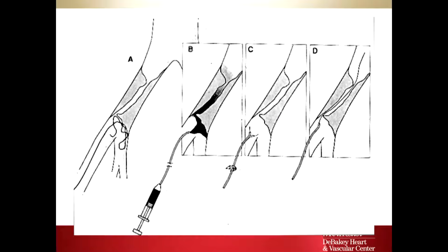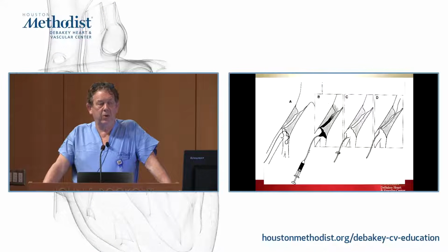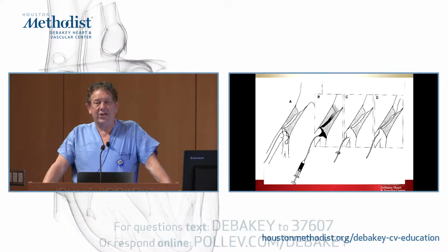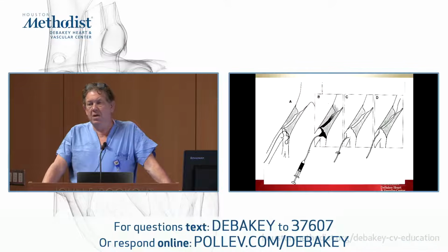If you look at the actual electronic simulator that's up there, there are stenoses in that. And we often talk about how you cross a stenosis. When you look at a stenosis, whether it's on a CAT scan or on an angiogram, there are lots of things that we're looking at. We're looking at whether it's eccentric or concentric and how tortuous it is. I'll give you an example.